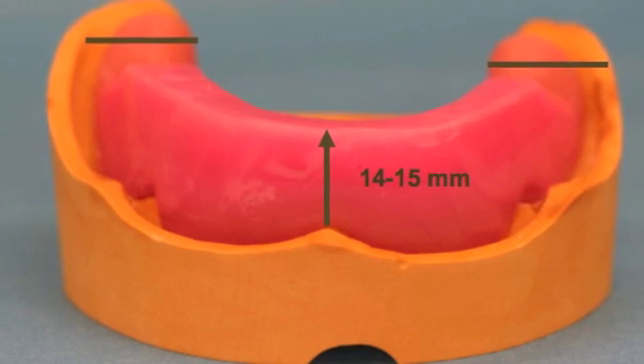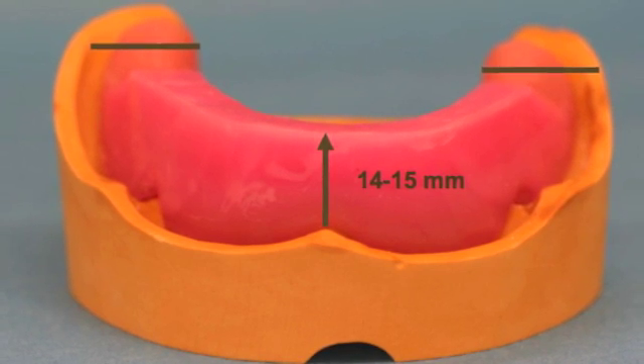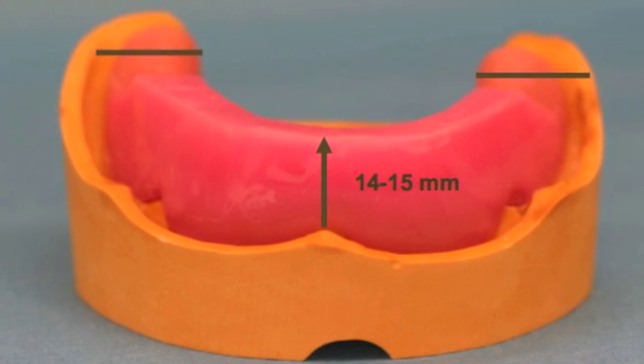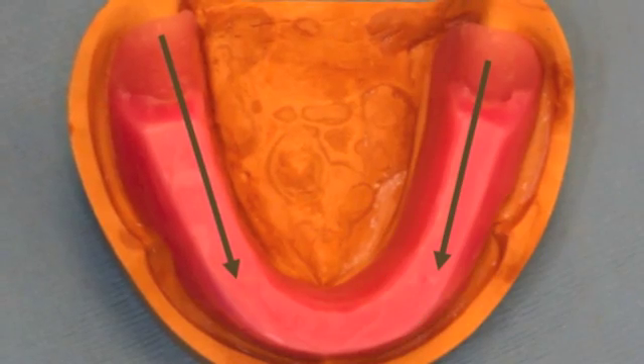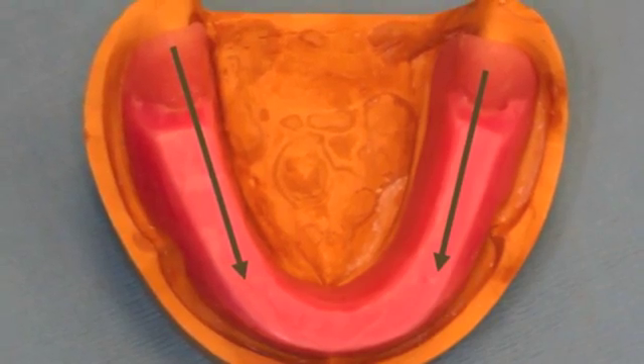For the mandibular arch, the anterior segment is 14-15mm high from the labial frenum and extends to align two-thirds the height of the retromolar pad as shown. This view shows the wax rim is centered on the crest of the ridge.